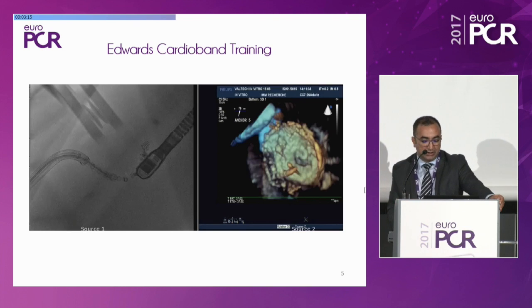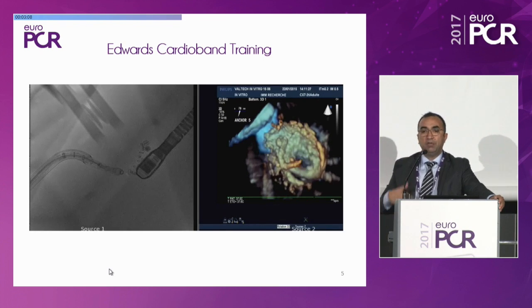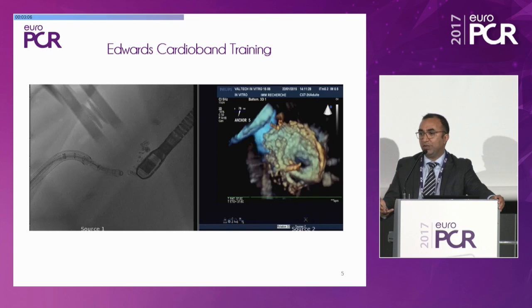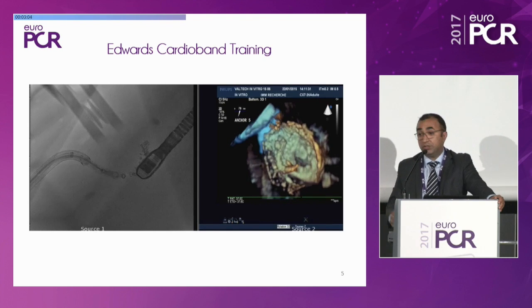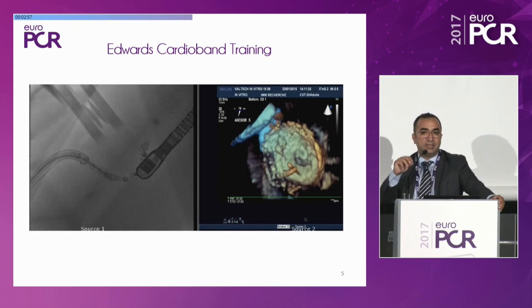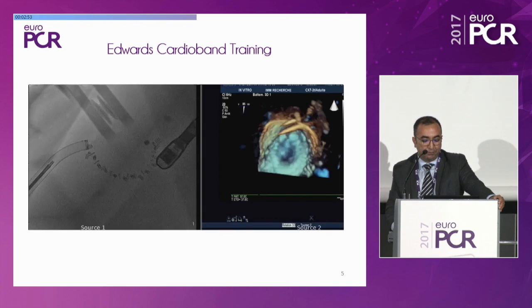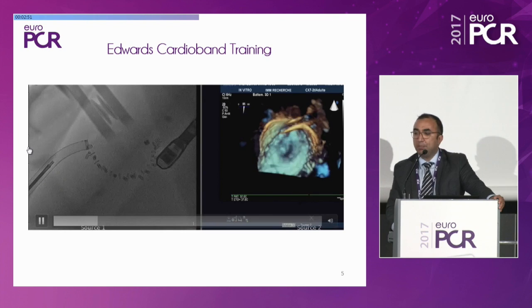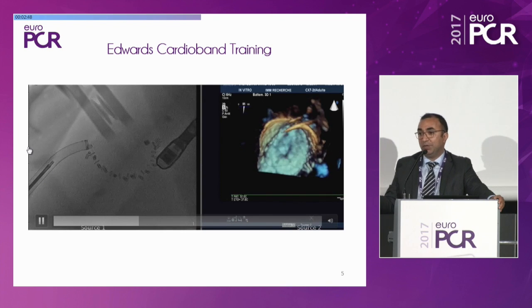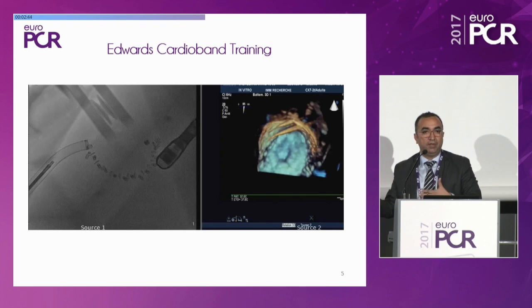So when I did my first procedures in human, I got the team to come around, and the day before we practiced, and I did it over and over and over again. And I could do it as many times as I wanted to, because it's a simulator. And I did that the first few times, not just the first procedure I did, to kind of learn the movements, understand what it is I needed to see when I was looking at the echo and looking at the fluoroscopy. And here you see an implant implanted, looks like it's on the human, but it's done on fluoroscopy, and it's done with echo imaging, but on a simulator.